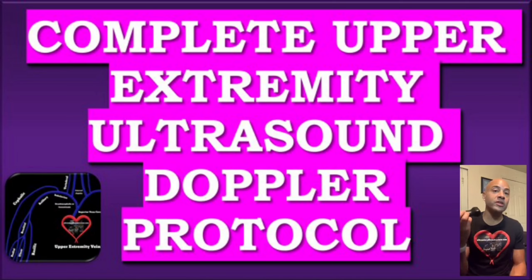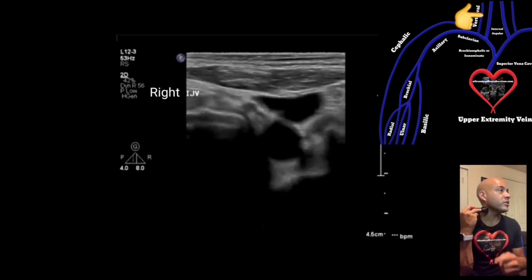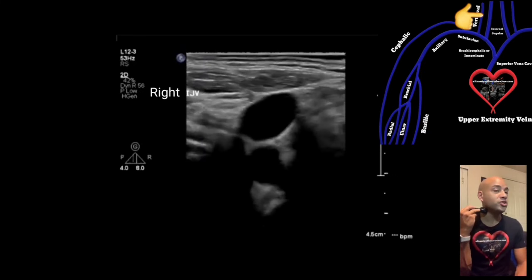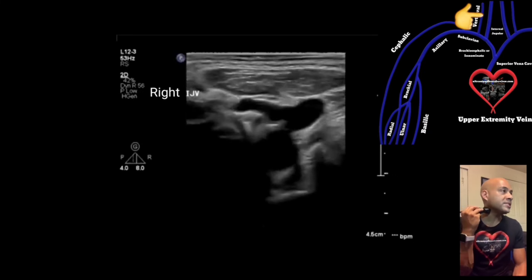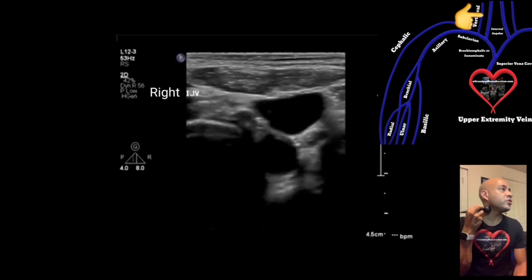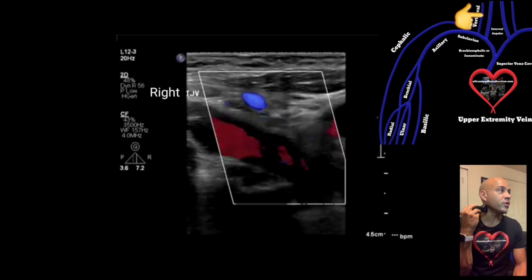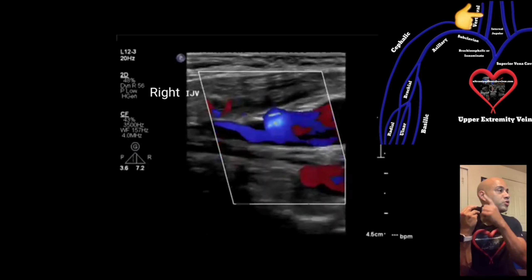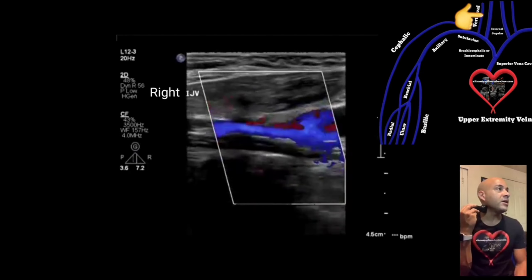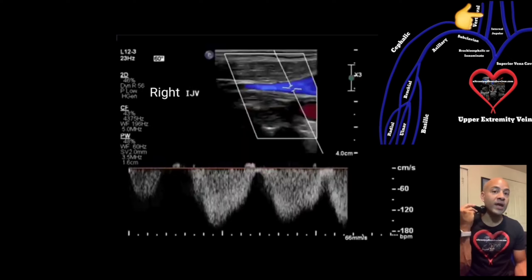With your transducer in the transverse position, place it on the patient's neck with your index pointed anteriorly. Acquire images in 2D while compressing the IJ to make sure there's nothing obstructing, like a DVT. Then turn your transducer to the long axis or sagittal view, with your index pointed superiorly towards the patient's head. Turn on color and take an image, then turn on pulse wave and acquire images with spectral Doppler waveforms.